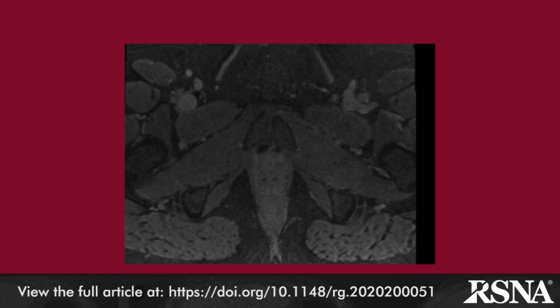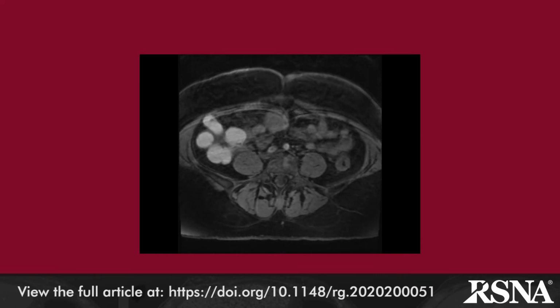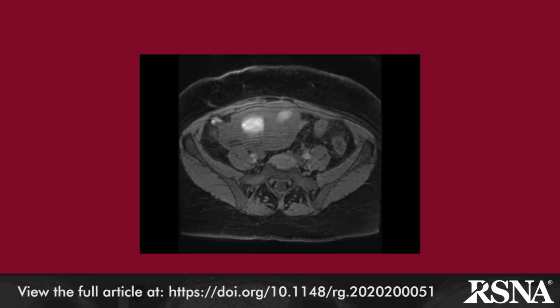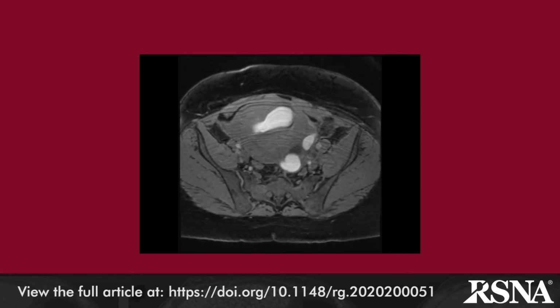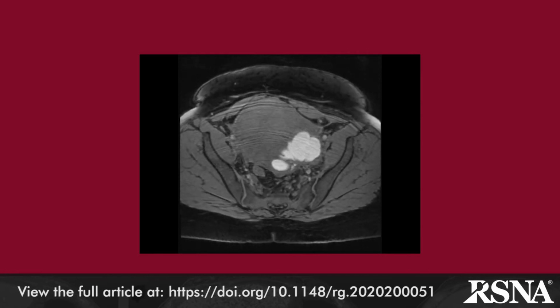Post-ablation tubal sterilization syndrome is a delayed complication of endometrial ablation for menorrhagia. Characteristic imaging features of post-ablation tubal sterilization syndrome include hydrosalpinx, hematosalpinx, or tubal inflammation that can be seen on ultrasound and, if occult, are better visualized on MRI.